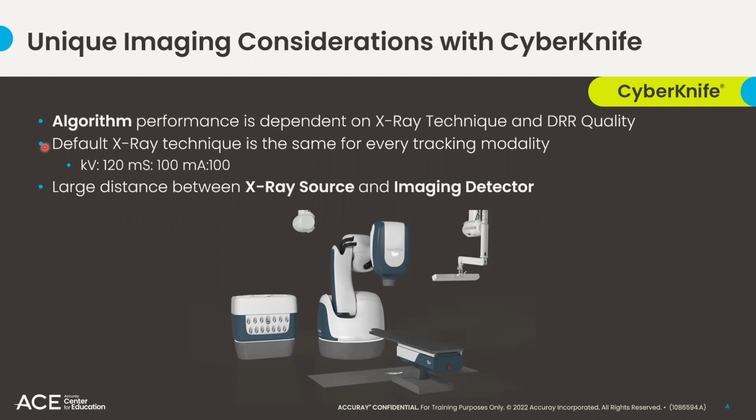Secondly, default X-ray technique may not be, or probably won't be, sufficient in almost every case. Accuray's intention of having a default starting point is to force the user to very thoughtfully consider each individual patient and what starting point technique is best for them.